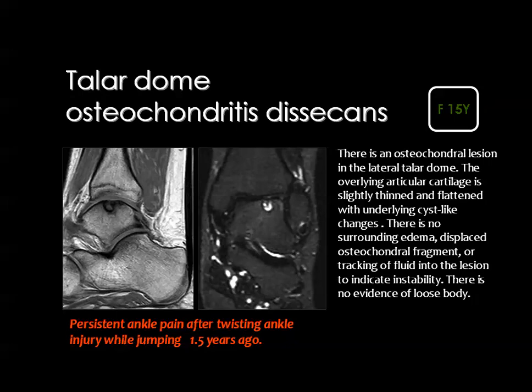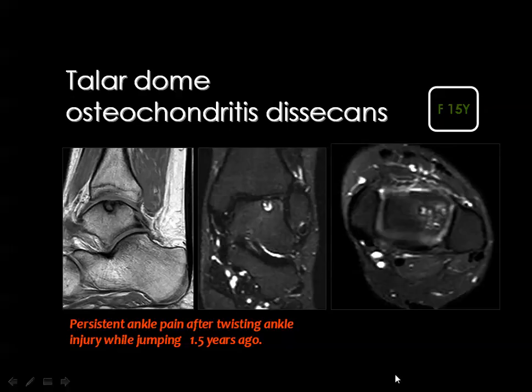Also, avascular necrosis of the talar dome we have discussed before when we said we have 4 grades of avascular necrosis of the talus, including grade 1 diffuse bone marrow edema, grade 2 separation of the dead bone from the viable bone by a line, then separation of the dead bone from the bone itself, then displacement of the separated necrotic bone.